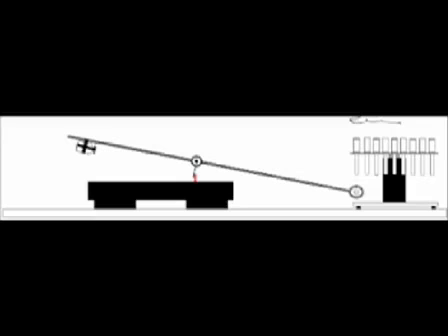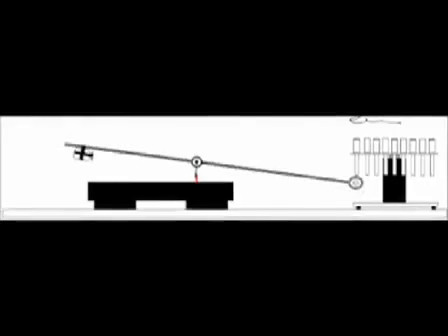On a lower table, hidden from the participant's view, a stepper motor rotates a disc that holds up to 40 stimulus pieces, positioning one of the pieces under the finger. A crossbar, shown here in red, extends from the movable carriage of a linear actuator, preventing the rod from pivoting. As the actuator motors forward, the rod pivots under the influence of gravity, pressing a stimulus piece upward through the tunnel and onto the skin.